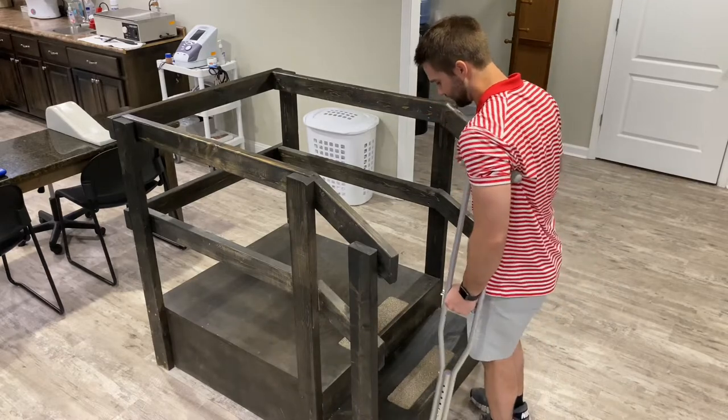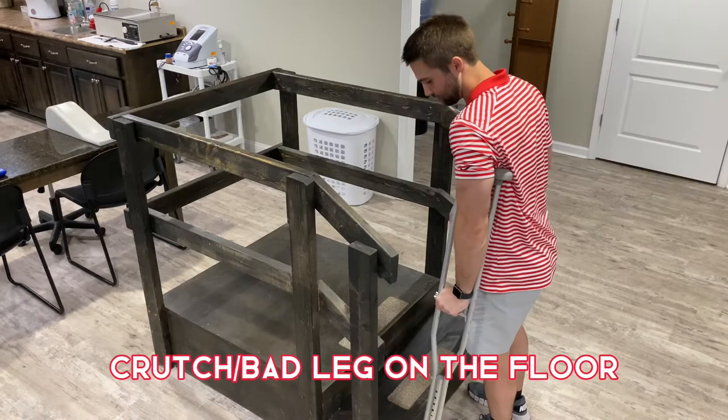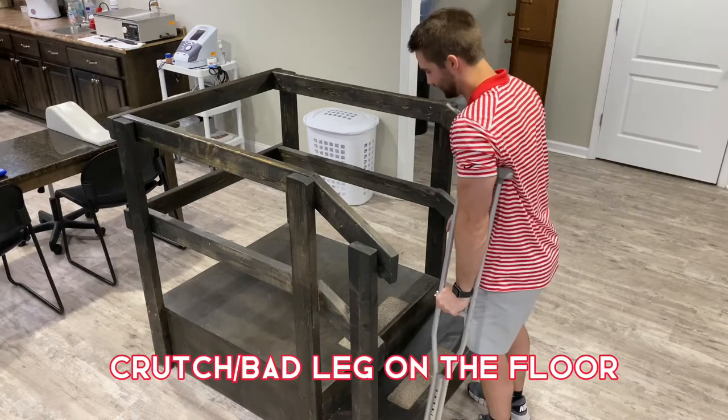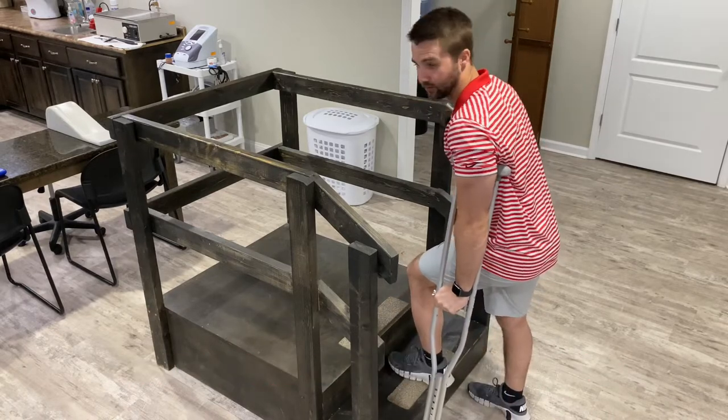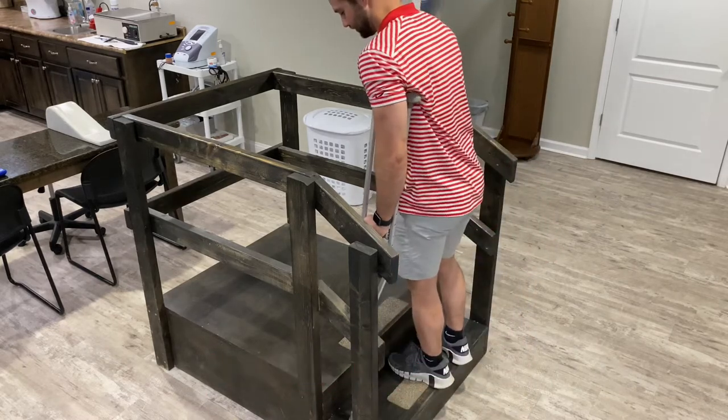I'm going to approach the stairs. We're going to put our crutch and our right foot down, put weight through the crutch, taking some off the right side. Then we're going to come up with our good leg first — coming up with the left — and then bring the crutch and foot with us.